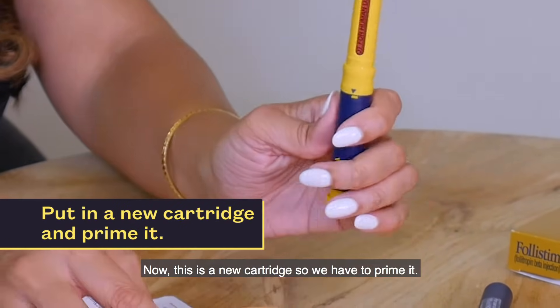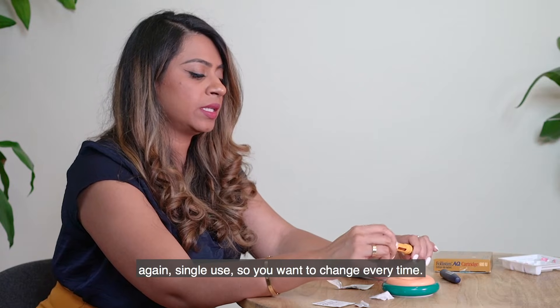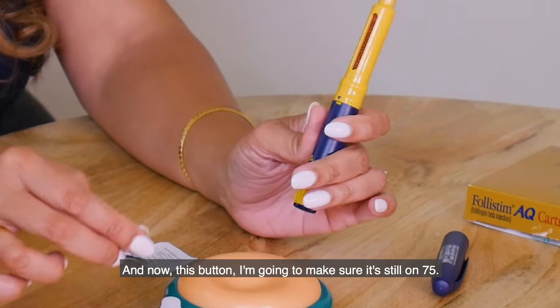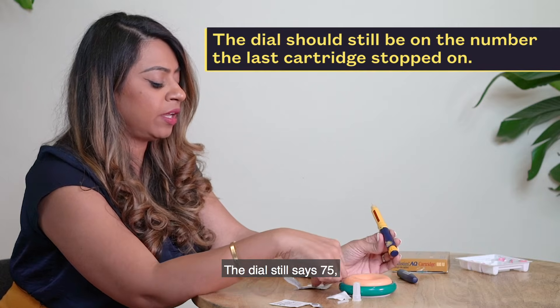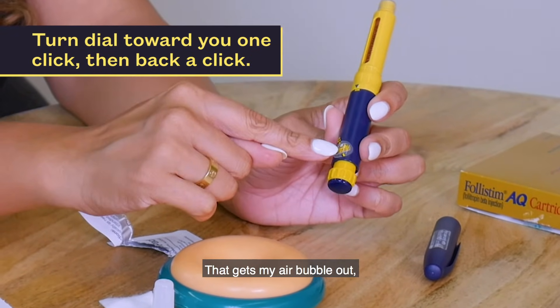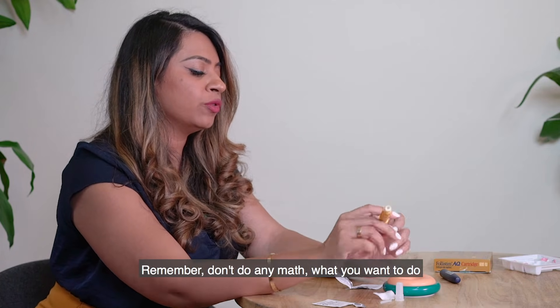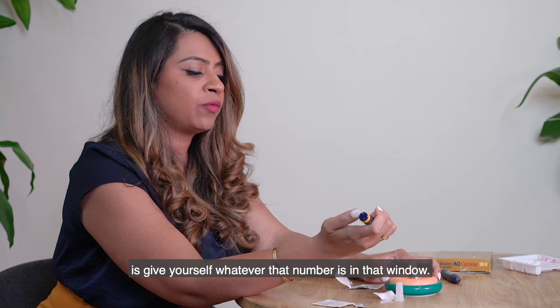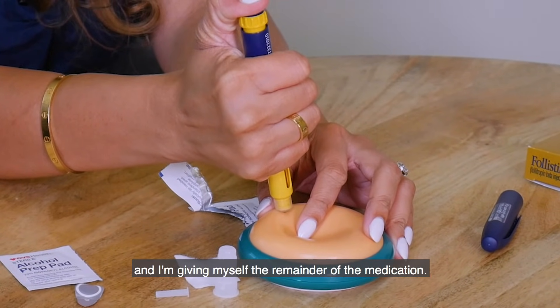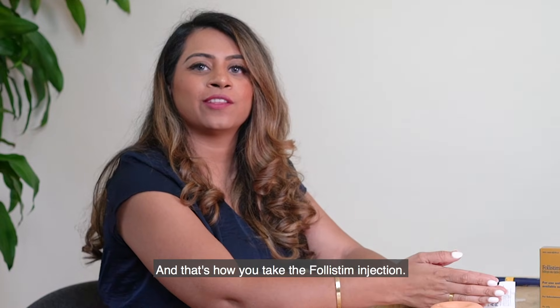Make sure your shapes match up. Since this is a new cartridge, you have to prime it. Clean the top off with alcohol and take a new needle — needles are single use, so change every time. Take off the cap and the inner safety cap. The dial should still say 75, so turn it towards you one click and back one click to prime and remove the air bubble — it returns to 75. Now give yourself the remainder of the medication: pinch, go in at a 90-degree angle, and inject. When you take the pen out, the dial should say zero, meaning you've received everything. And that's how you take the Follistim injection.